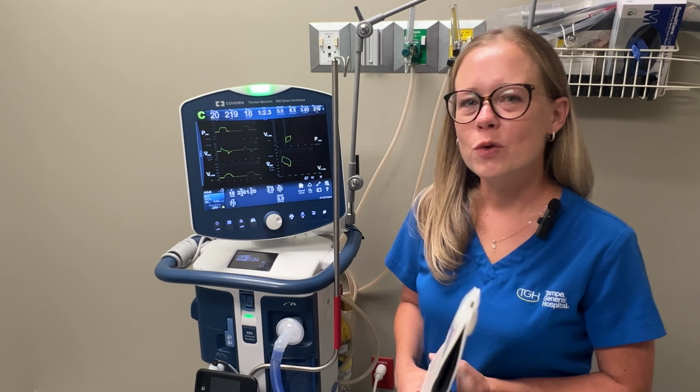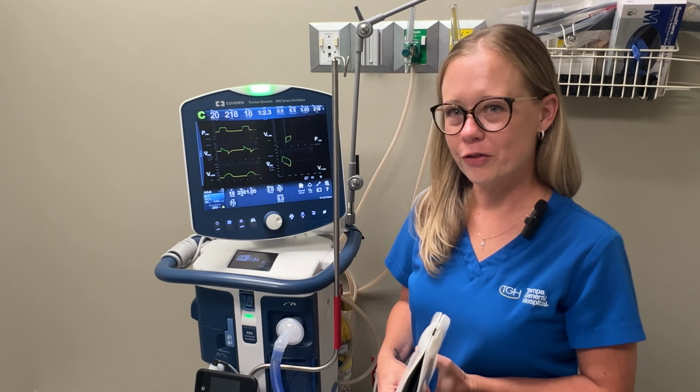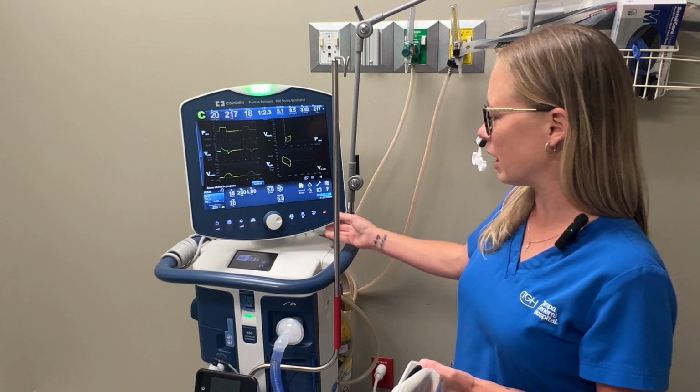Okay, now if you suction your patient and the patient starts to cough, your peak pressure is probably going to get pretty high while they're coughing, and the vent is going to alarm. To silence that alarm, you press this button right here. That is the alarm silence button, and again, you get a timer. The vent tells you alarm silence in progress, and you also have a cancel button.